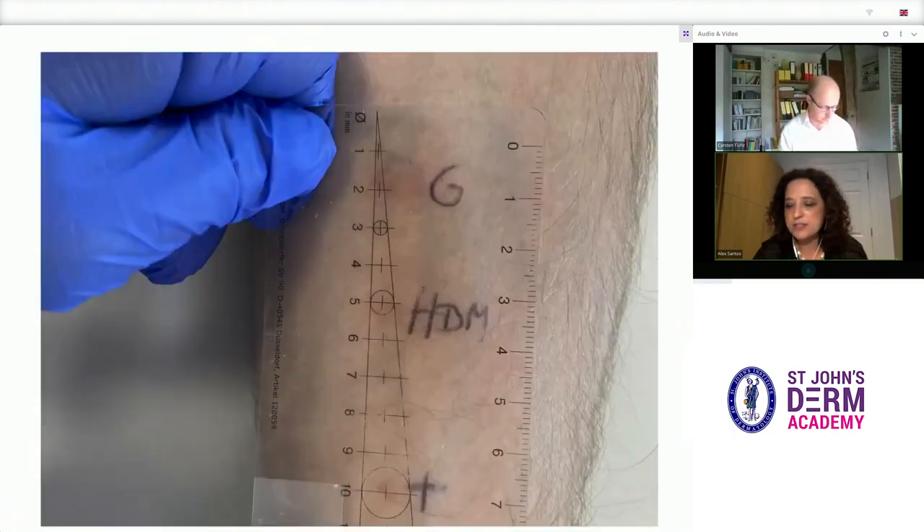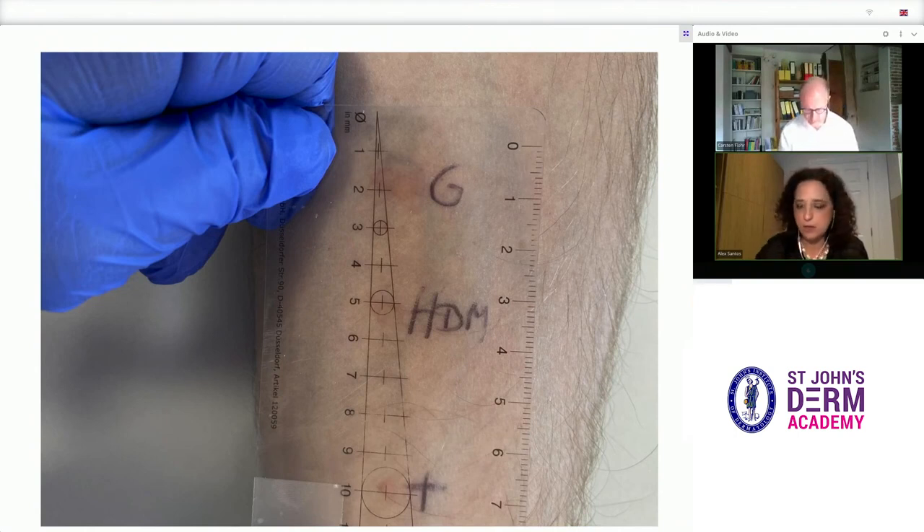Test solutions are standardised to give a mean wheal of six millimetres. A wheal of three millimetres or more is generally considered to represent a positive response, indicating sensitisation to the allergen. Karsten has a positive result to the positive control, as expected, and also to Timothy Grass and house dust mite.